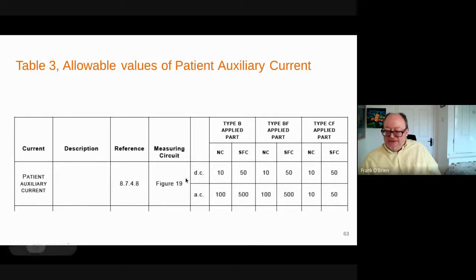because it's DC. So DC, we have very low limits. We think there could be cell necrosis. Now, if you look at the latest reference standards, that would not support these limits. 2 milliamps would probably be supported by newer research, but the standards retain these conservative values.